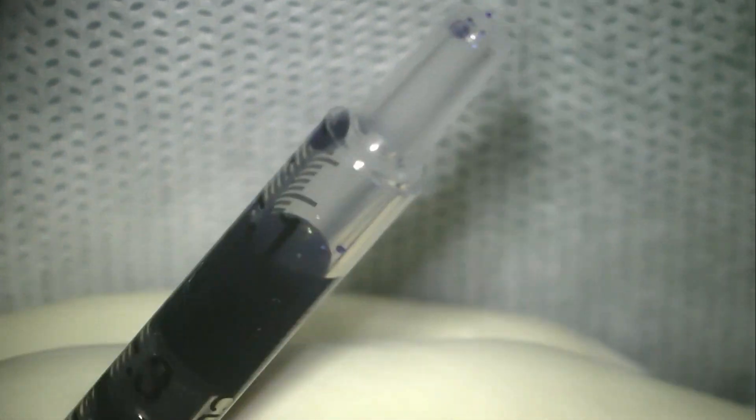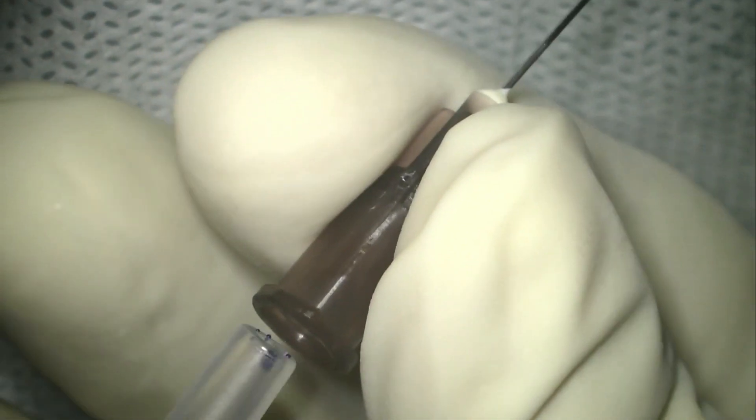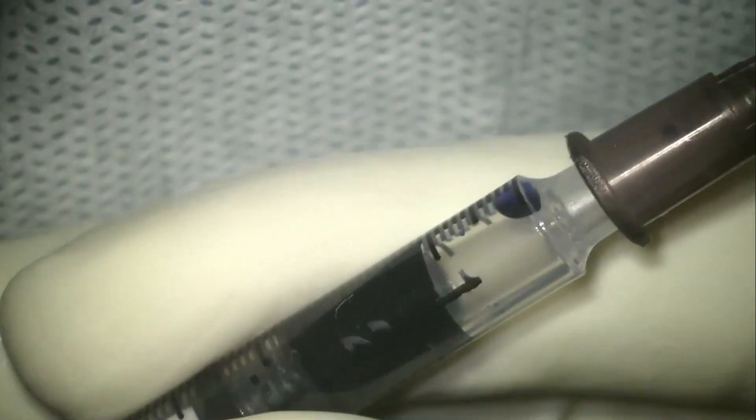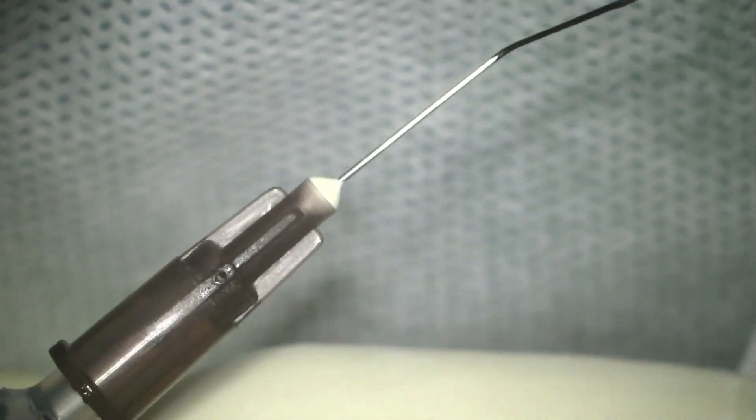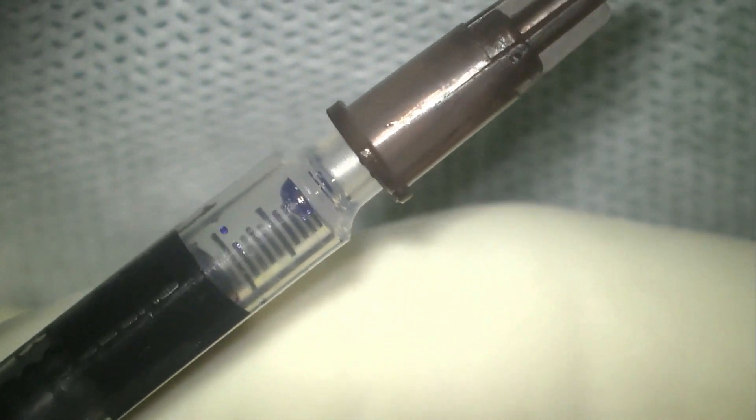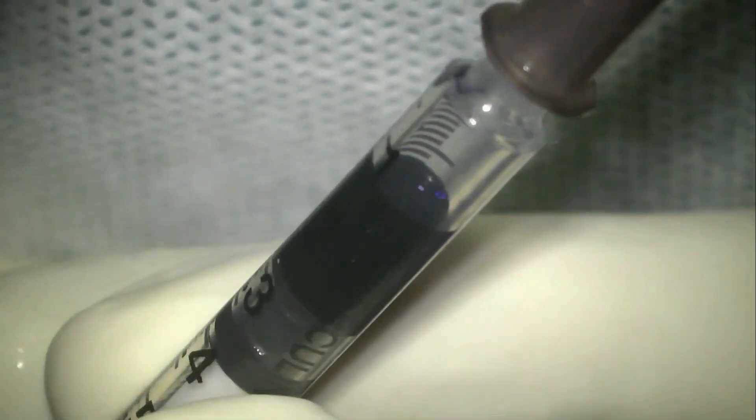The piston is then withdrawn a little further to allow a small amount of air in front of the blue dye. This is then connected to a 27-gauge flattened hydrodissection cannula, as you can see here, and now you are ready to inject the blue dye into the anterior chamber.